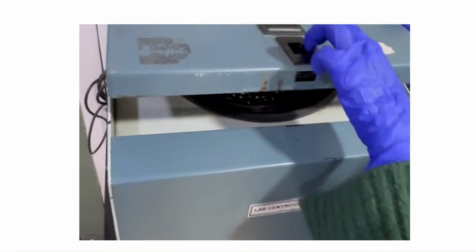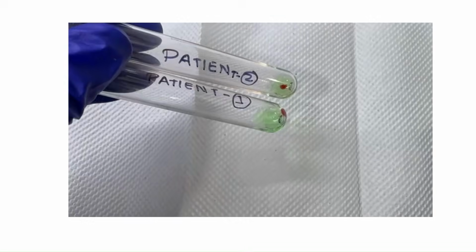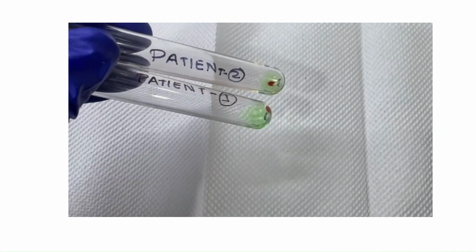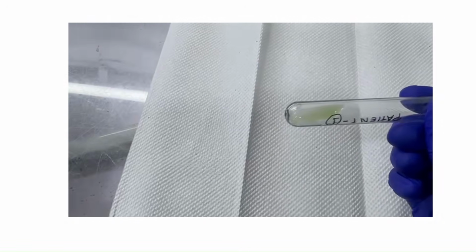Then centrifuge the tube by proper balancing at 1000 rpm for 1 minute. Take out the test tube from the centrifuge and gently shake the test tube to look for agglutination reaction.